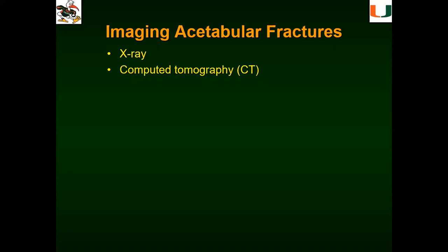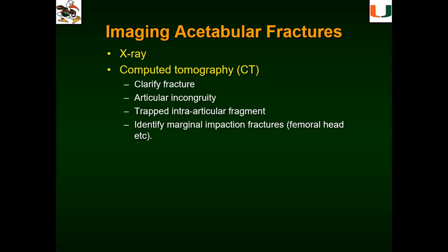head displaced, because the longer amount of time that the femoral head is displaced, we know from the literature, there is a higher incidence of concomitant long-term complications, such as osteonecrosis of the femoral head and neurovascular injury. So the orthopedic surgeons, the trauma surgeons know to reduce that femoral head as quickly as possible. So we don't like to see on CT that the femoral head is out.